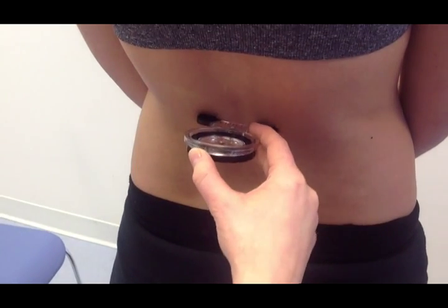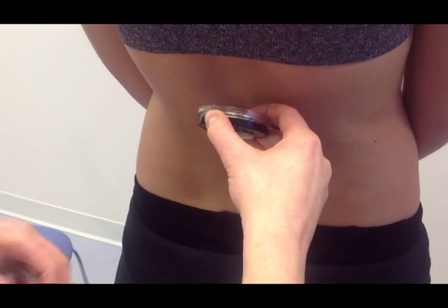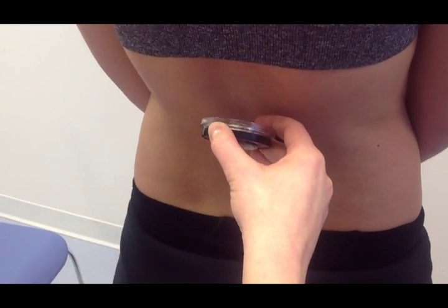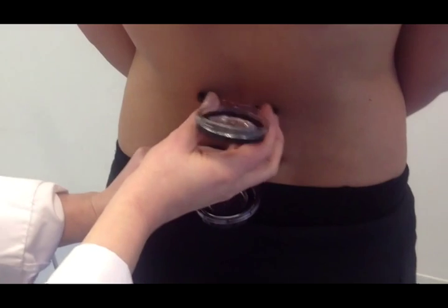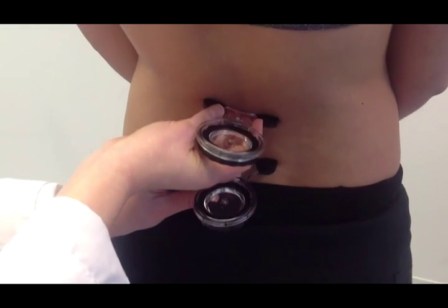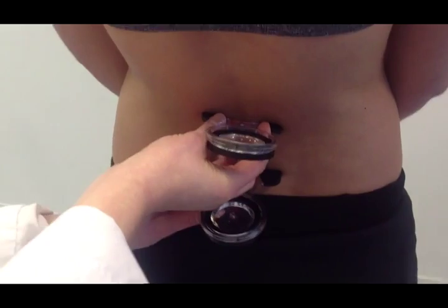The second inclinometer is going to go at our other landmark, S1. Once you have found your landmarks, you want to go ahead and have your patient bend over.